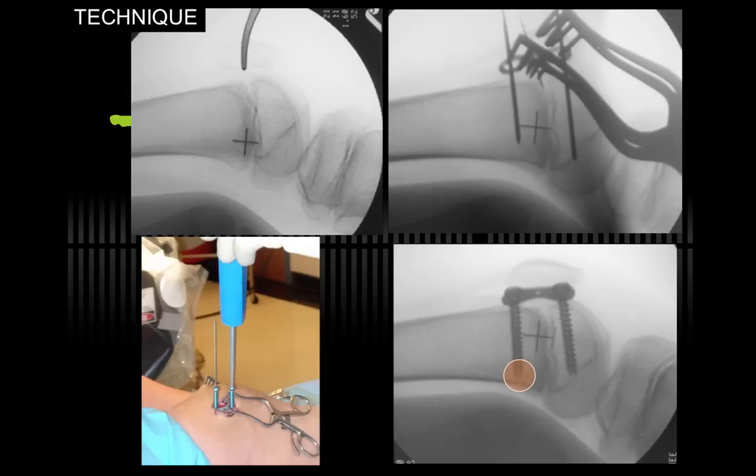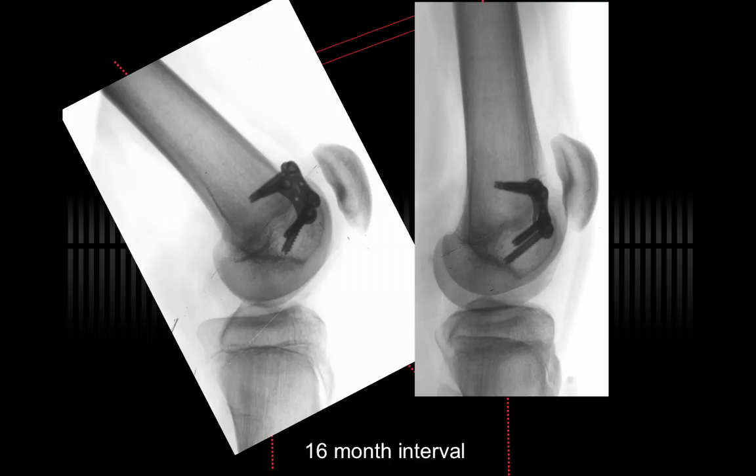The technique is quite simple. The image intensifier is placed in the horizontal position with the knee over a flexed bolster. The physis is identified, as you see on the top left, inserting a guide needle, followed by the plate and the guide pins, followed by the cannulated screws. The circle on the bottom is to remind you not to use the longest screw. This is a 32-millimeter screw, but with the femur growing distally, it may become prominent through the cortex later. So 24-millimeter screws are sufficient.